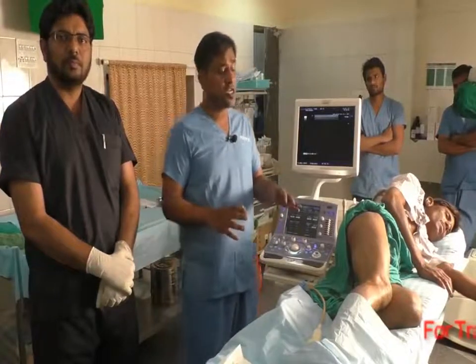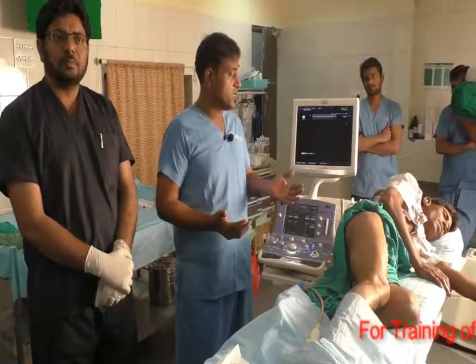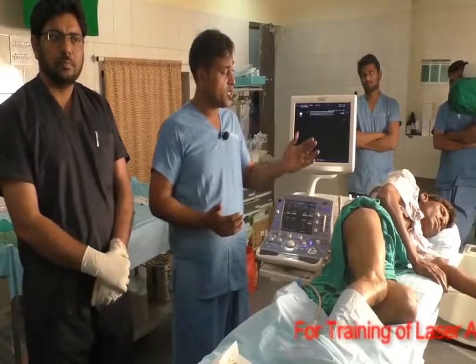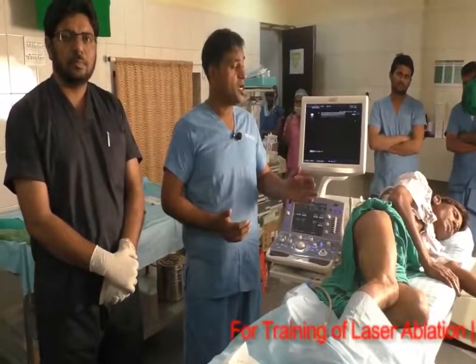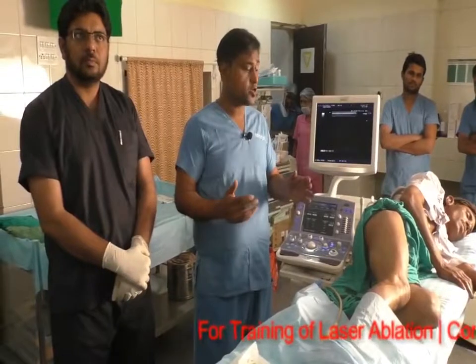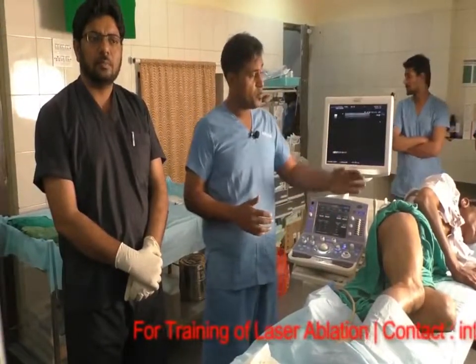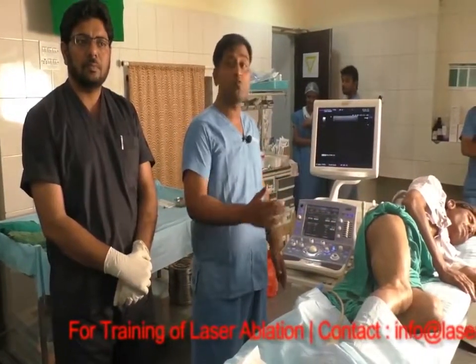Generally there are three modalities by which we can do laser. Pre-procedure we do give anesthesia. First, we can do this procedure under spinal anesthesia. Sometimes people prefer to do it under tumescent anesthesia, but at our place we give femoral and sciatic block, and then popliteal block, along with tumescent anesthesia.